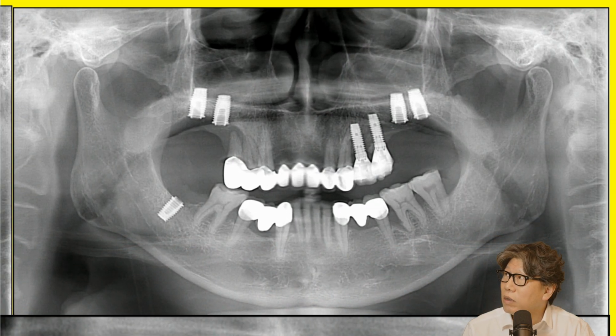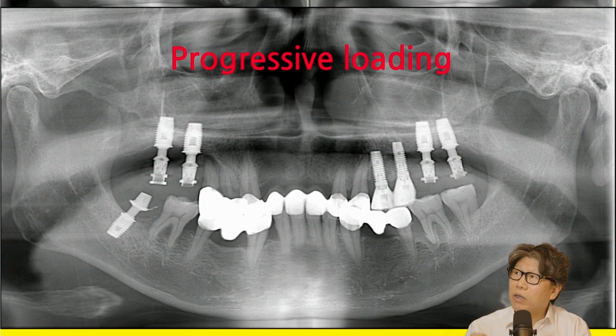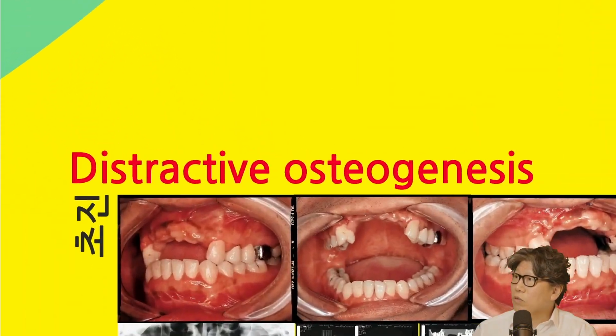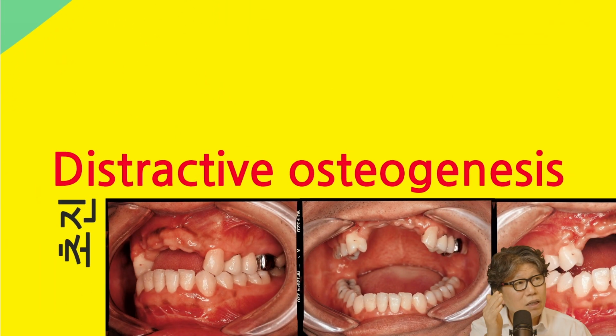So if you look, I'm doing temporization like this. You can see that the bones are holding up well. That way, if you don't address the sinus with a socket lift, or a lateral approach, or a window technique where you're deficient, you're not going to increase the number of implants anyway. I mean, we're counting how many procedures we're doing a month. If that's not increasing, I think that's probably something that you need to think about.